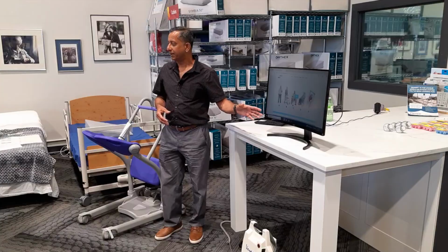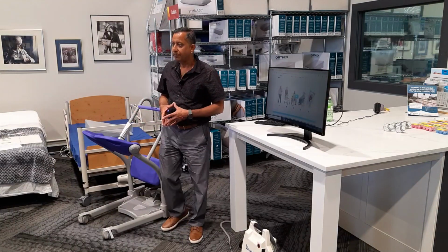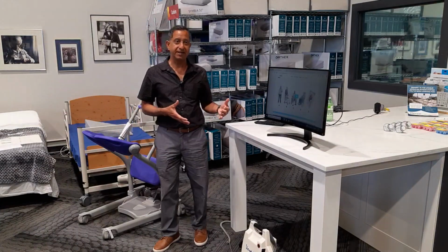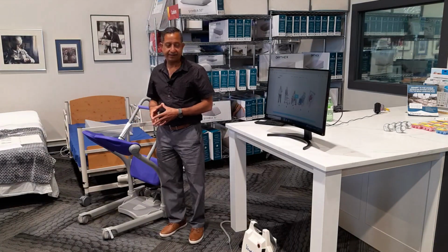Albert is someone who is mobile, uses a cane to walk, and doesn't need any kind of help or assistance from a caregiver. Then comes Barb. Barb is on a walker. She sometimes needs some assistance in getting from point A to point B. However, most of the time she can be independent.